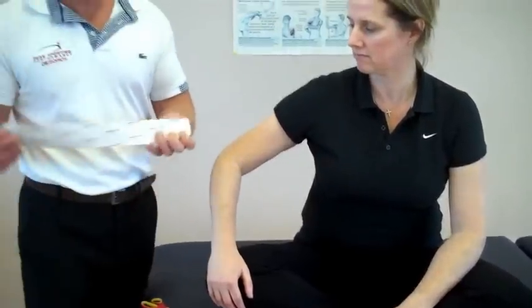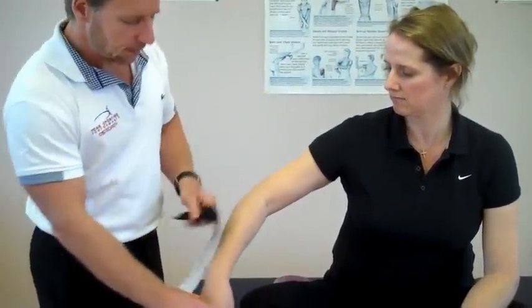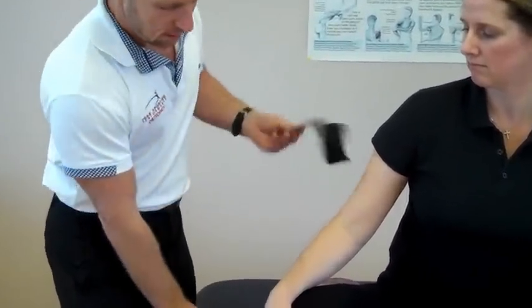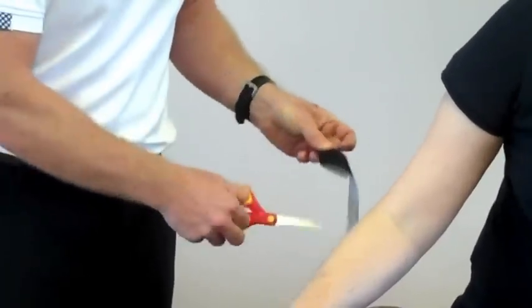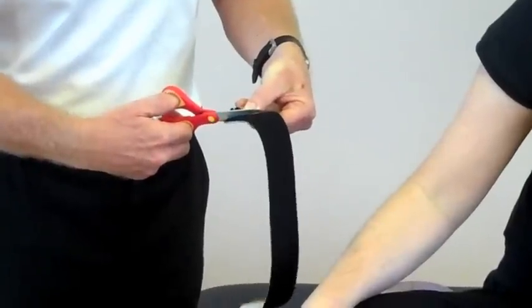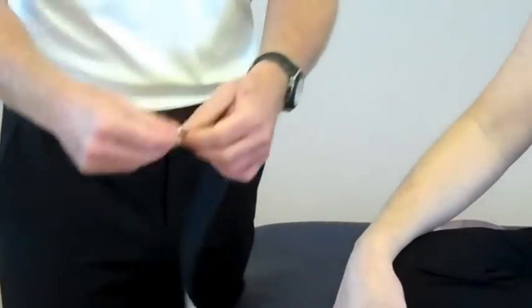What we've got is one I-strip, which is a bit longer than normal, and an I-strip that's been cut into a Y. First, you've got the two squares on the back of the tape. Fold it back so one square fits over the other square, then cut a triangle shape on one area and repeat the process twice. So you've got two triangles, and when you straighten the tape it looks like a kite. Turn it over and then split the tape.